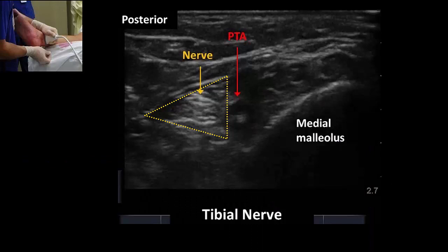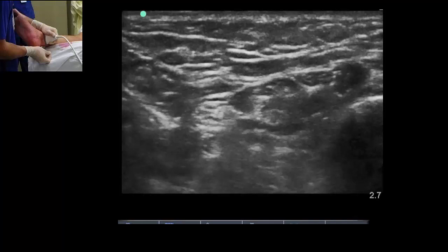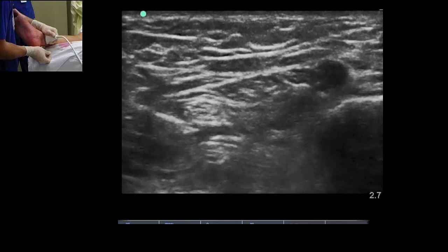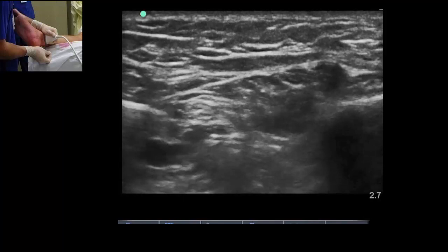This video illustrates the process. The tibial nerve is posterior to the artery within the usual triangular fascial compartment. The needle is advanced in plane in the posterior to anterior direction to pierce the fascial compartment adjacent to the nerve. If using a block needle, there will be the usual fascial pop. Injection of local anesthetic confirms the correct position of the needle tip by producing spread that outlines the contours of the nerve, with the tip at eight o'clock producing spread along the inferior aspect. Repositioning the needle tip to ten o'clock will produce spread over the superior aspect of the nerve.